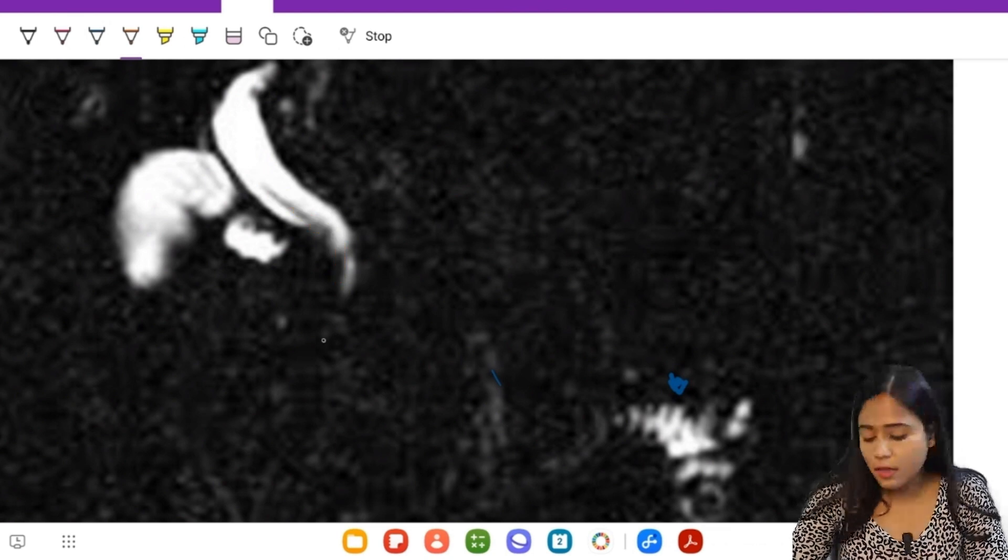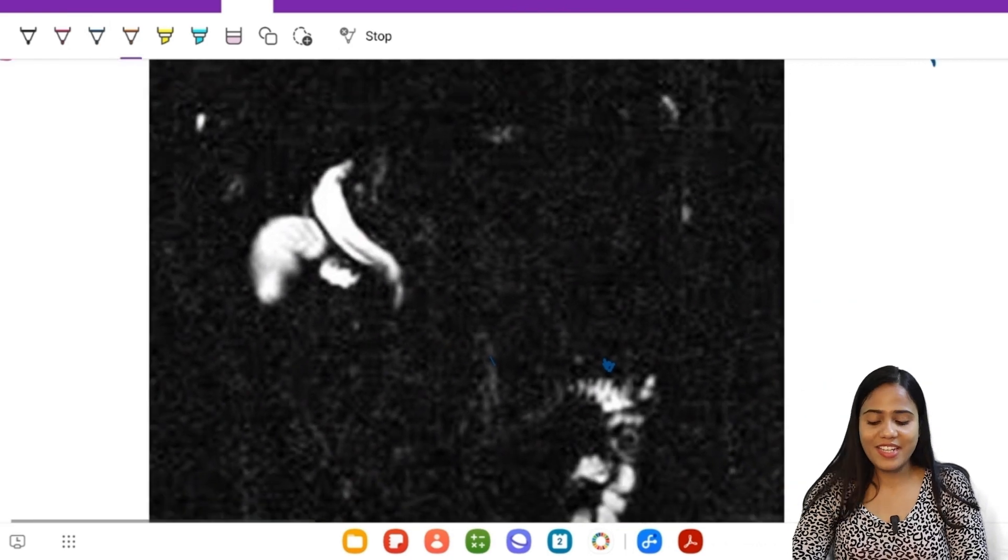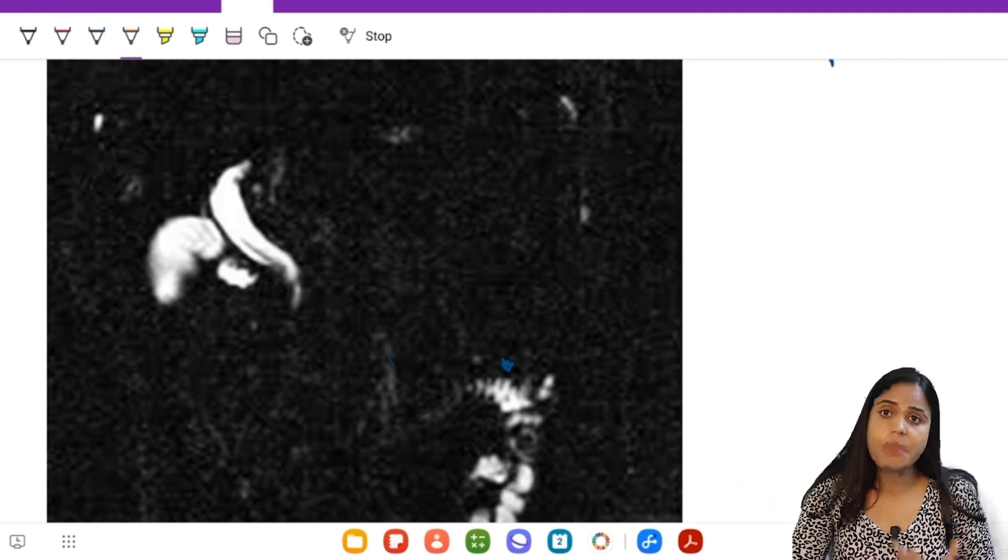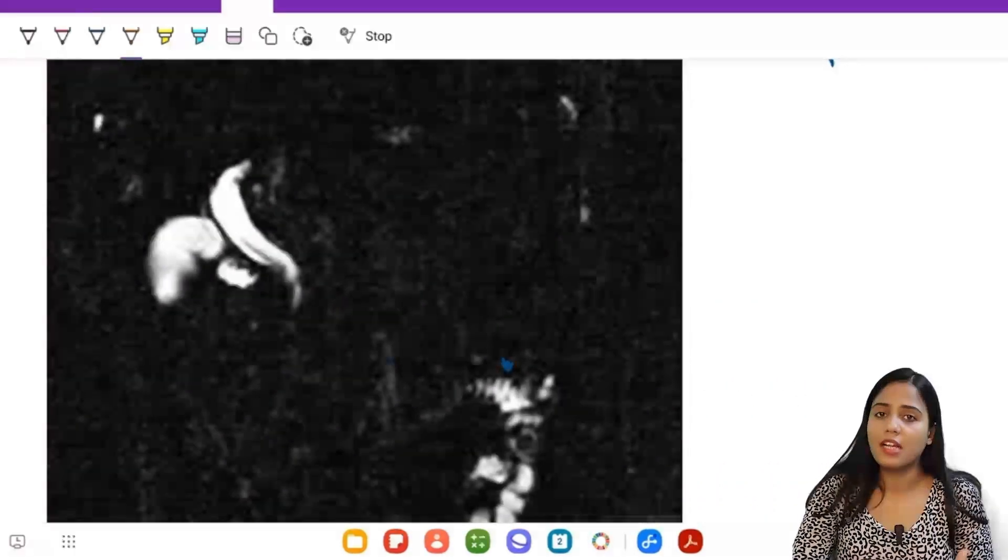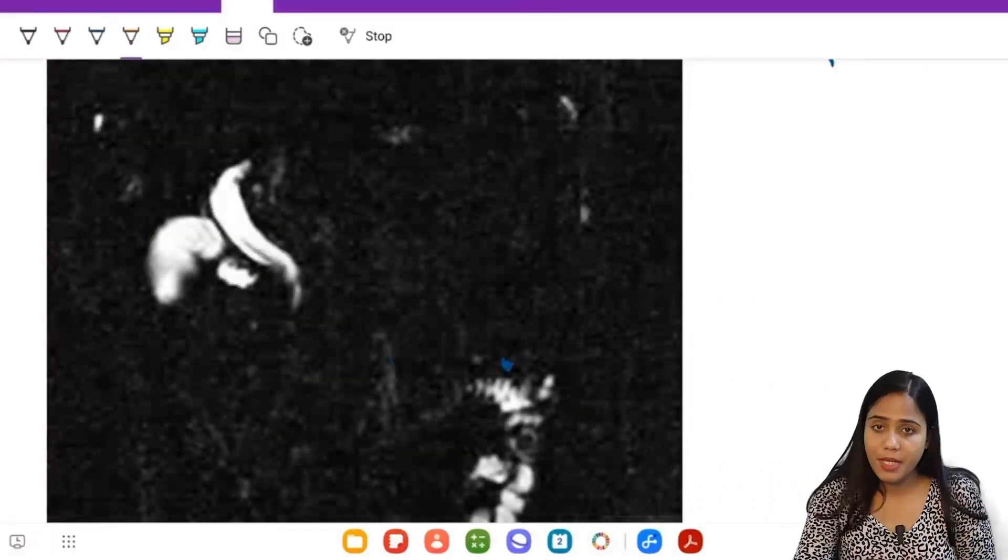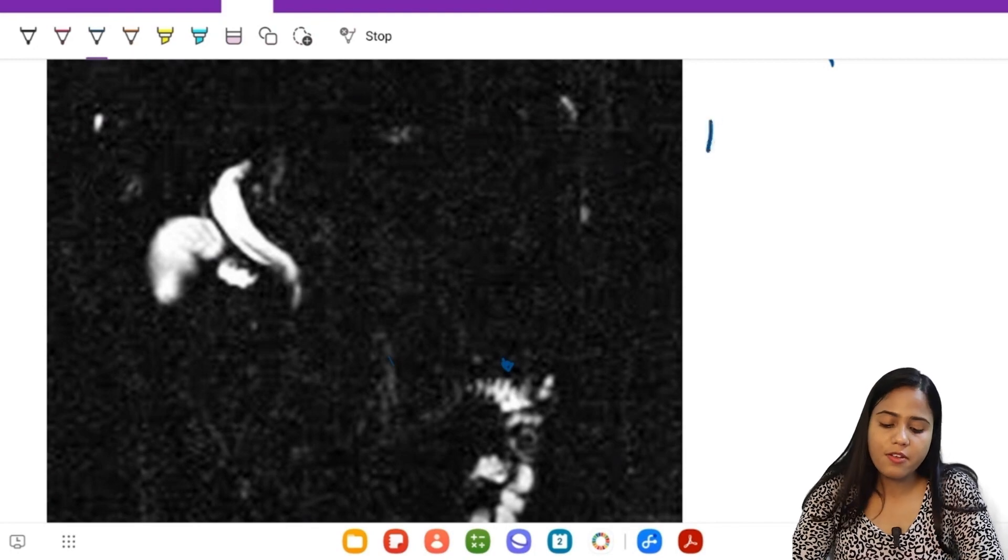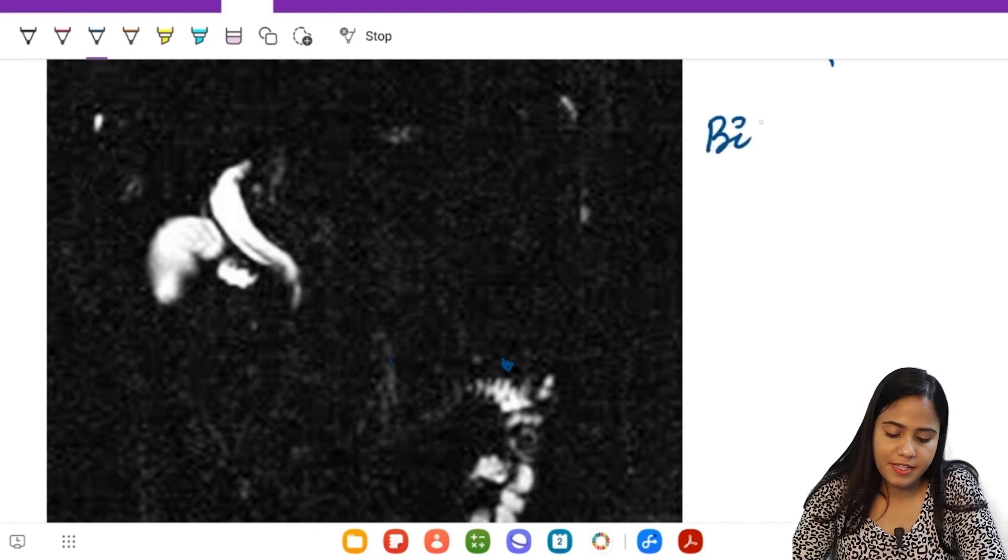Yes, what is this? Very easy. This is obviously based on the shape, it's not a calculus, so what common other thing can it be? Yes, it can be worms. So this is a case of biliary ascariasis.